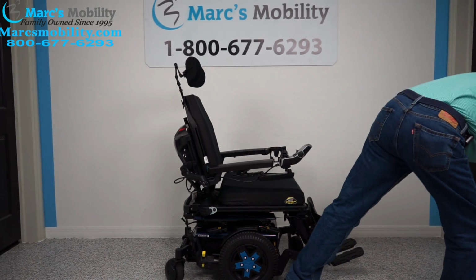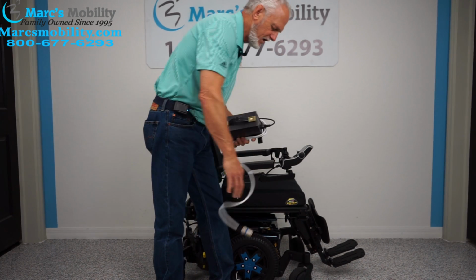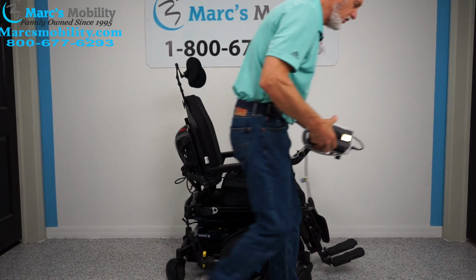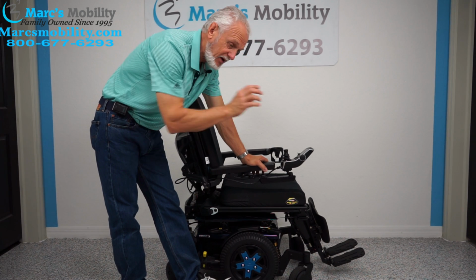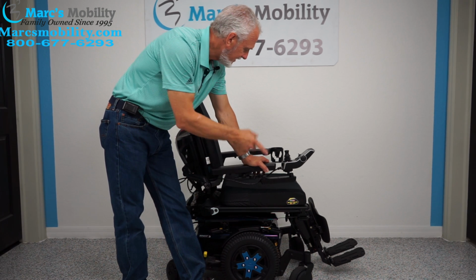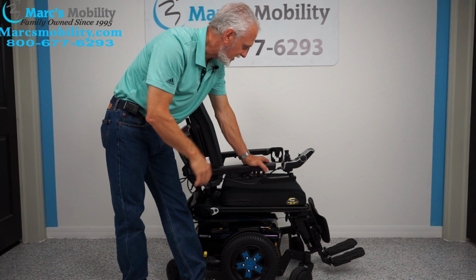When you charge this chair, you'll take your charger that we're going to send with it. You're going to plug it right here. And as soon as it goes from orange to green, when it turns green, the charger stops charging. There's 2 batteries in this chair. They'll give you about 15 miles on a battery charge. That all depends if you're outside, going uphill, in the grass, the weight of the user. So that's going to affect your distance, but that's a good gauge, okay?